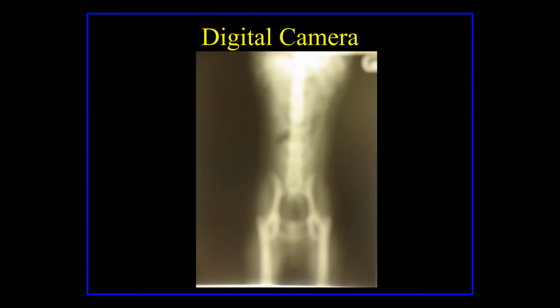Oh, this is kind of funny. Back in the old days, when people started trying to do digital, they would take pictures of X-rays and send them to me, and this is typically what I would get. They would put an X-ray up on a view box, take a picture, and send it to me. And then they would get upset because I'm saying, I can't read that. It's crap. I can't read that. And we had to get through that kind of stuff. But anyway, hopefully those days are kind of gone.